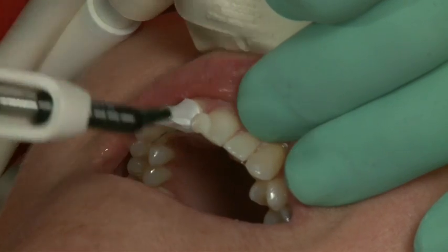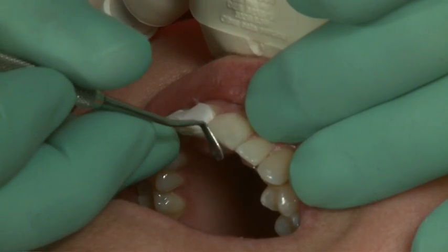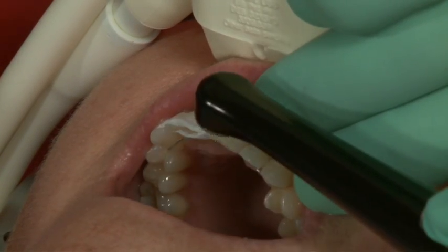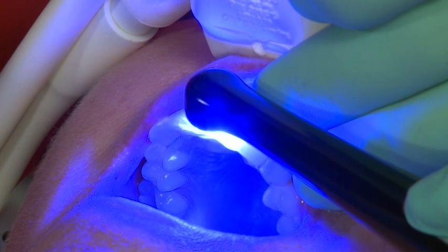The Velo is a broad-spectrum light — I like that fact. The old halogens were broad-spectrum. That's important to me because I want it to cure everything I point it at. I don't want to have a different light to cure this resin or another light to cure that resin. One light should do it all, and that's what Velo does.